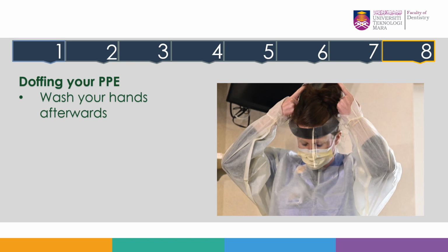Lastly, doffing your PPE. So after you finish the disinfection process, you may now remove your PPE according to the doffing sequence. Okay, so hopefully you still remember your doffing sequence from our previous units. Please do that. And lastly, definitely you have to wash your hands.